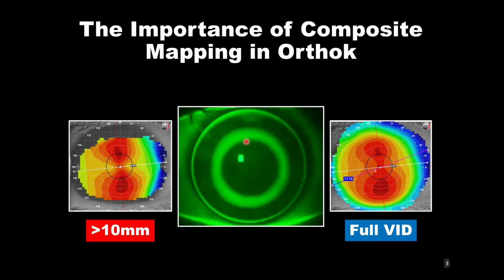So this is very beneficial, especially related to today's modern corneal GPs, and specifically orthokeratology lenses that are 10.6 as a starting point and usually up to 11 millimeters. So if we have only 9 or 8 millimeters of data, like many of the large cone topographers provide, we're not getting enough information to understand where the lens should be landing and on what surface shape and elevation is that.